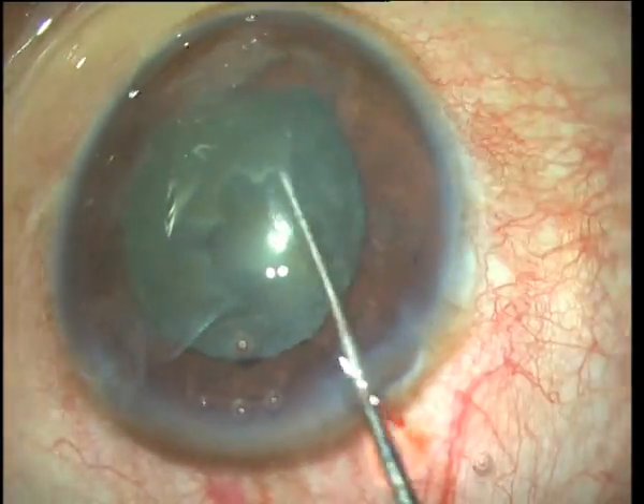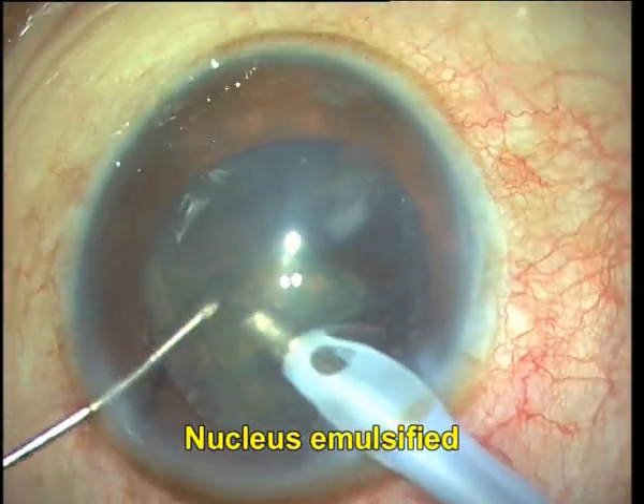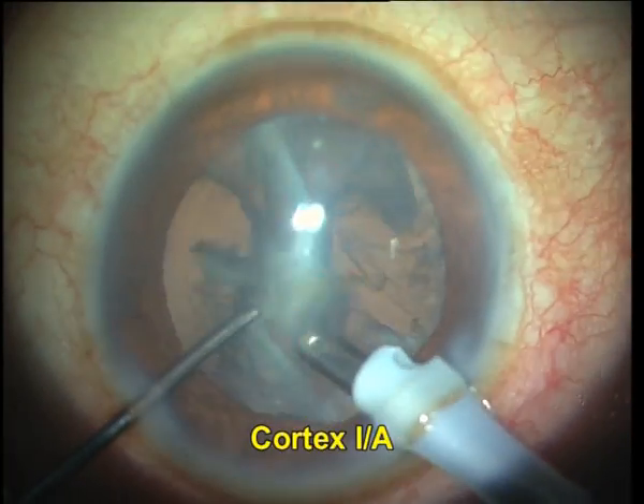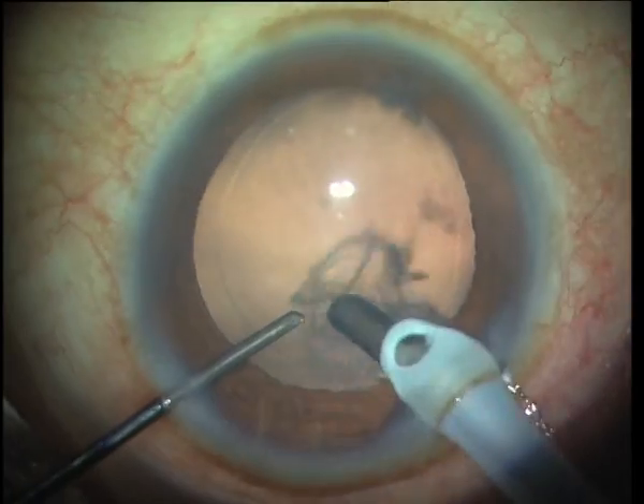I have hydroprolapsed the nucleus out into the anterior chamber and I emulsify it within the anterior chamber. Once the nucleus is emulsified, I turn my attention to cortex removal and we do it using the IA probe.